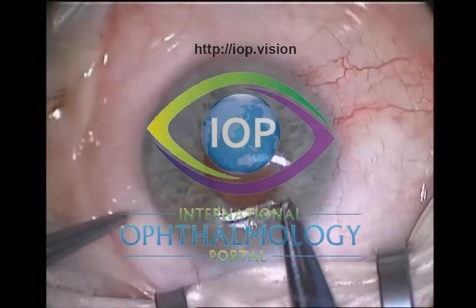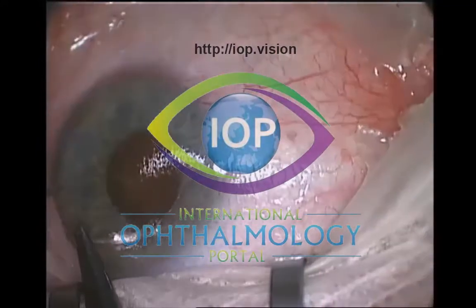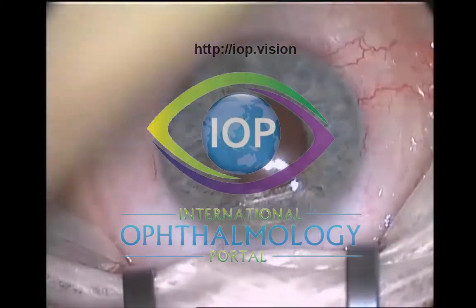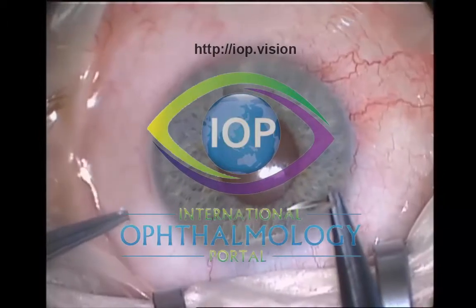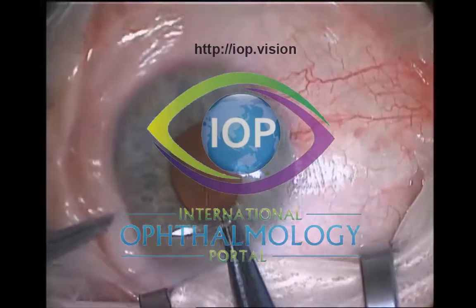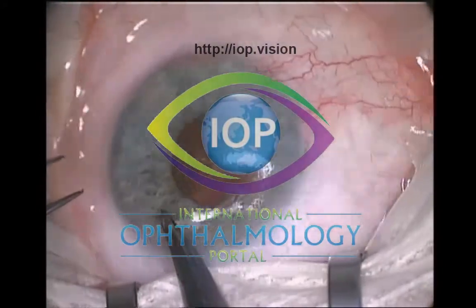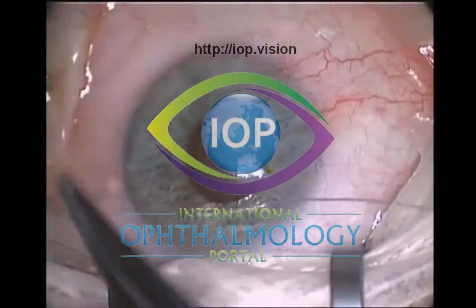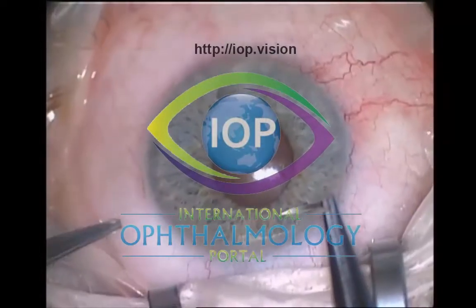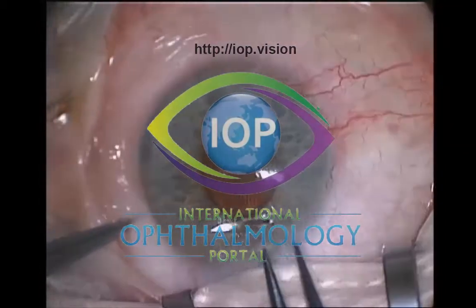This is the initial corneal traction suture and I like to use a 7-0 Vicryl. The needle itself is held just lower than you would normally, a bit lower down on the needle, so you get a nice flat pass. You want the needle to be fairly deep in the cornea - not too shallow otherwise the suture will tear out, and not too deep otherwise it will go into the anterior chamber. If you get a leak you need to take the suture out and reposition it in another place in the cornea.